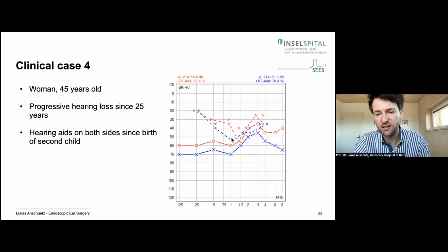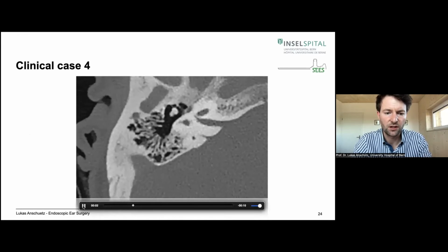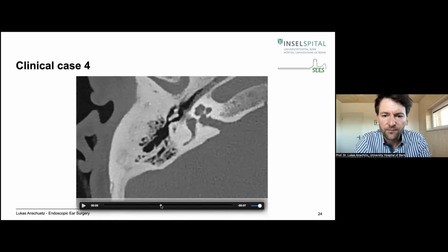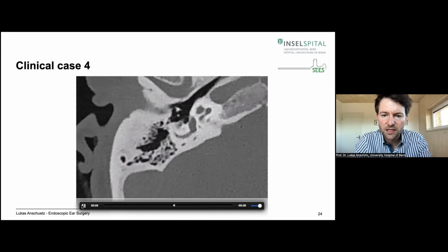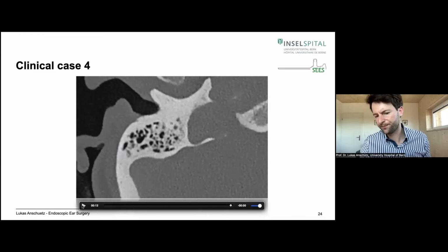But of course, if you look at this inner ear, she will need hearing aids all the same, even after a surgery. So you can see I usually do a CT scan for otosclerosis. I know not many people do it, but if you look here, you can have a hint of some otosclerotic, otospongiotic focus in the fissula and the fenestra, and it allows me to also exclude a minor syndrome or any other pathology inside the ear and plan my surgery accordingly.